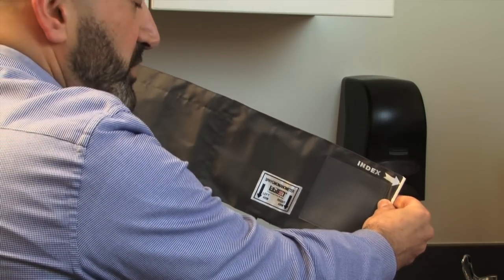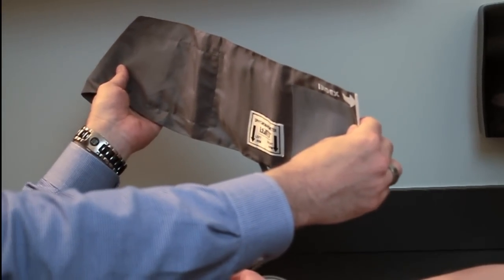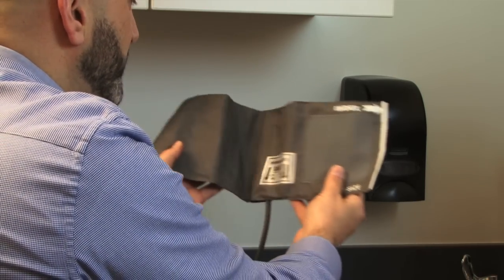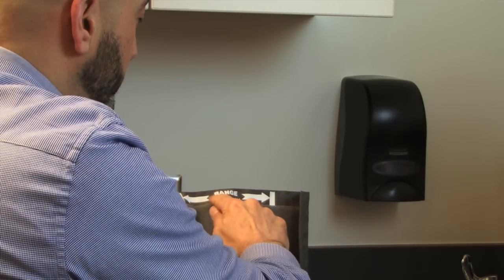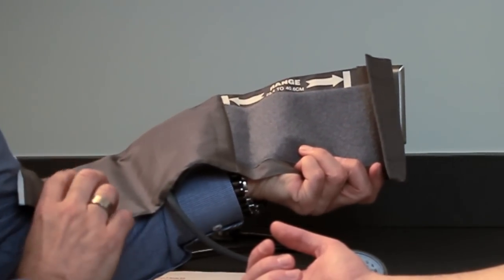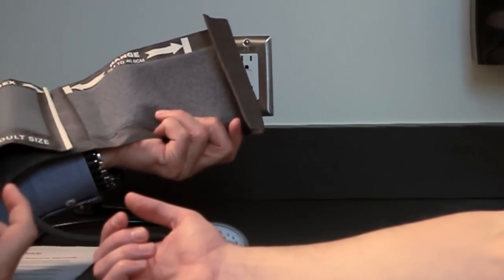This is a standard adult-size cuff. There are two ways to determine whether the cuff is properly sized: you can measure the circumference of the patient's arm and confirm it falls within the cuff's reference range — for a normal adult that's 25.4 to 40.6 centimeters — or you can place the cuff on the arm and make sure the white index bar falls within the reference range.